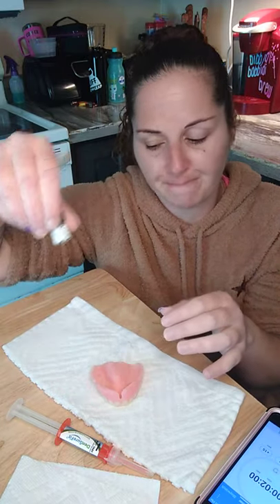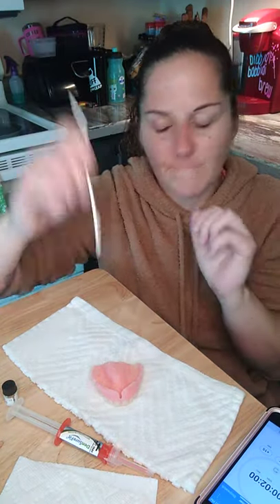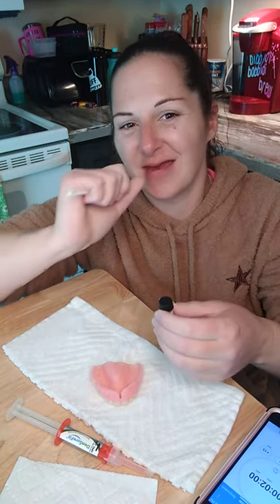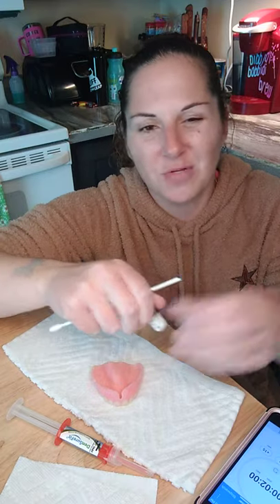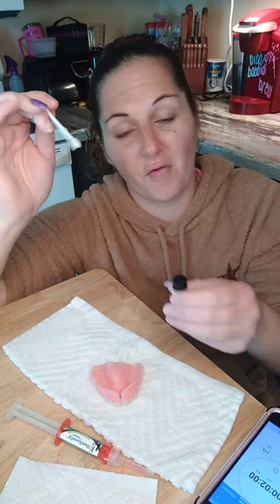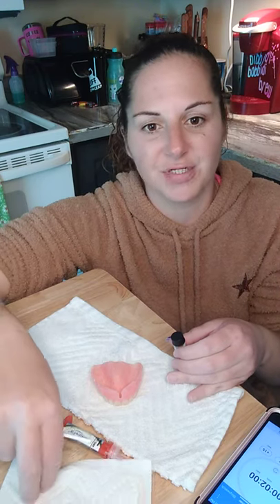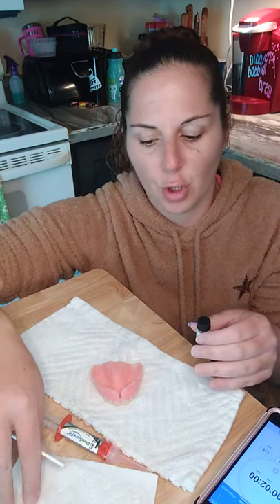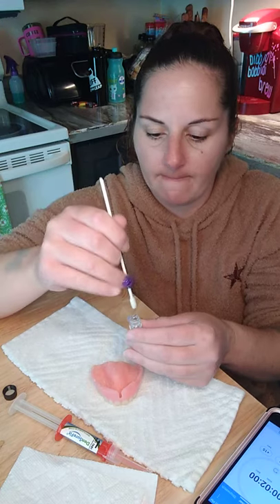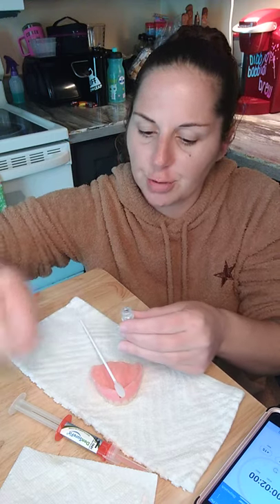So first we do the primer. It comes with these little trusty swabs, and you do a quick dip. Quick, easy peasy dip. I'm going to talk with you guys while I do this, because once I get it in my mouth, I'll be able to talk to you guys. So I'll be talking to you as I'm doing this. Open your primer. Before I open mine, I put a washcloth down to be safe, and I also have paper towels in front of me just in case. You want to be super, super safe. You guys know how I am with that. So you just take a quick dip, and lay it on my denture.